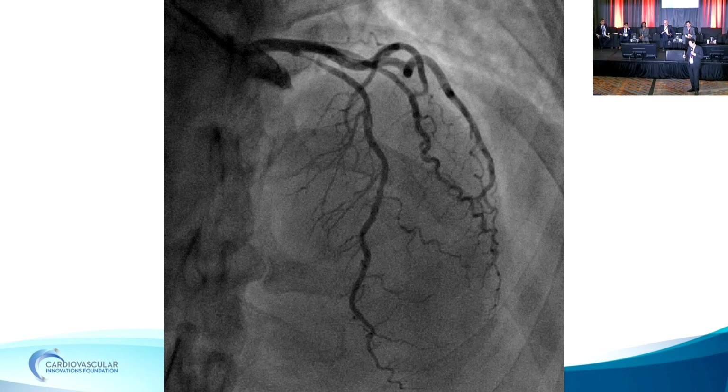Final, this is a case from elsewhere. SCAD and TIMI-3 flow, you don't need intravascular imaging. There is an intimal dissection flap. I think in the modern time, I would manage this conservatively and watch the patient in-house for 5 days because of the risk, about a 17 to 20% risk of extending in that 5 days, and then you'd balloon angioplasty. But I think you give conservative therapy a chance.